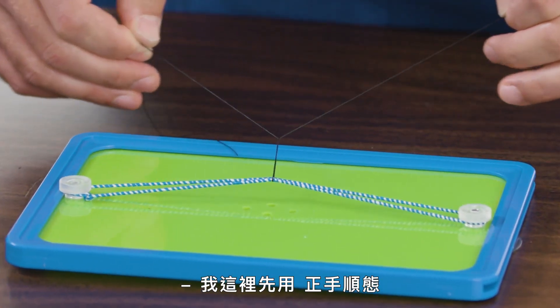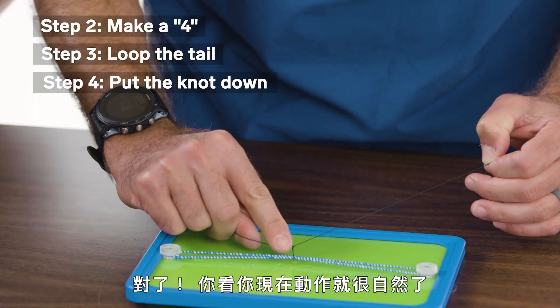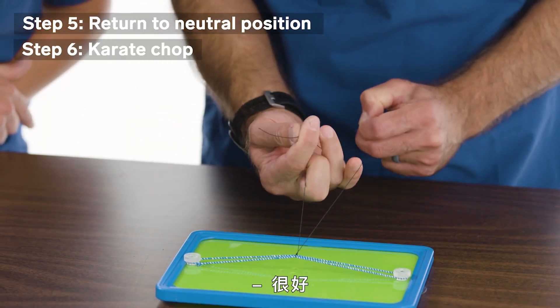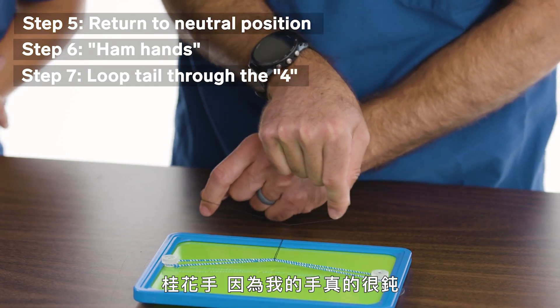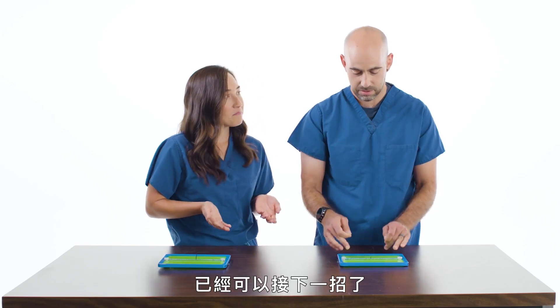Let's see — forehand throw. Use your... yes. You see how your hand sort of crawled up the suture? That was very instinctive. That's perfect. Now karate chop. In my brain this is ham hands because I have ham hands. No, you have beautiful hands. You have healing hands.